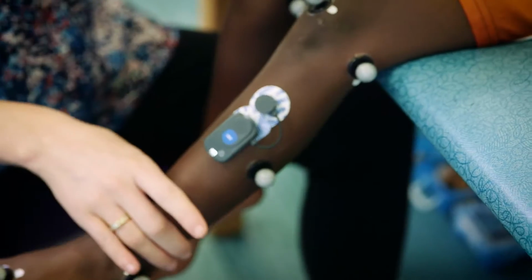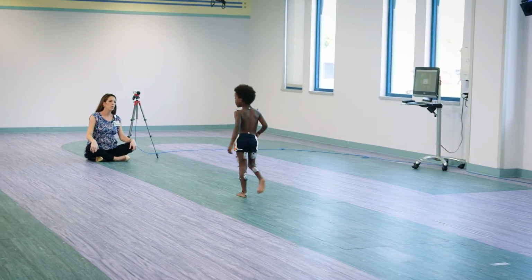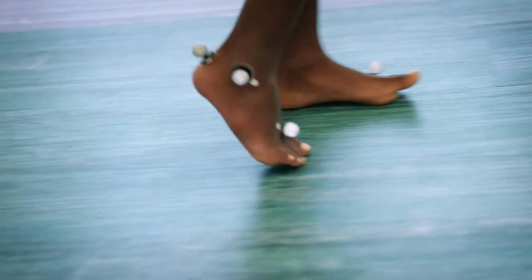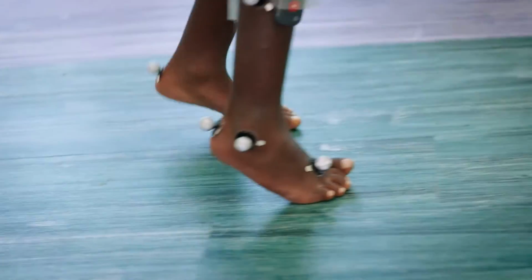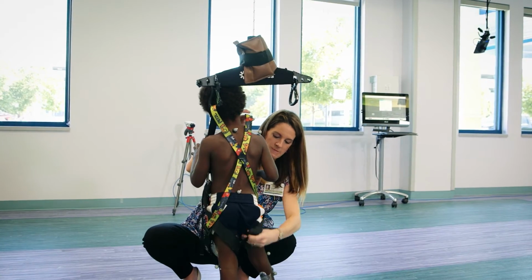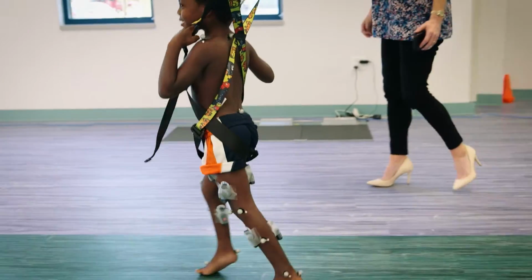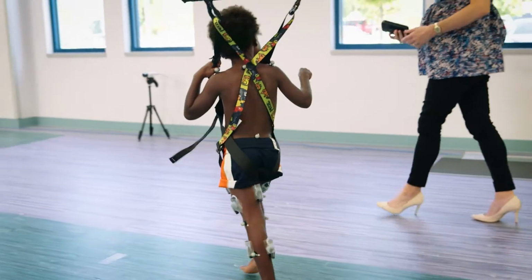In addition to that, we use wireless EMG sensors on their muscles. We also have over 12 force plates hidden in the floor. By integrating a sophisticated harness device into the lab, with our interventions, are we supporting less of their body weight over time? We have our plantar pressure mapping system that allows us to map the child's foot.